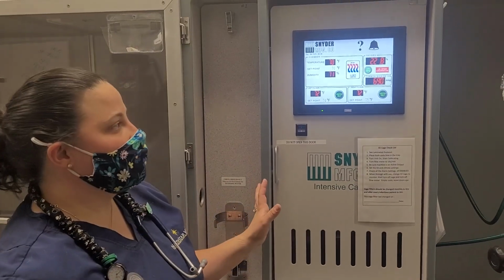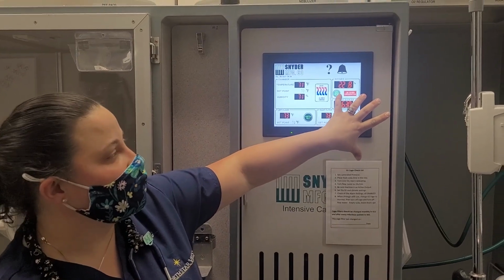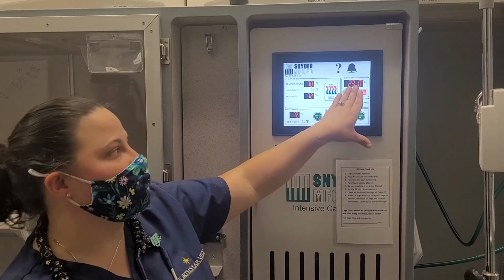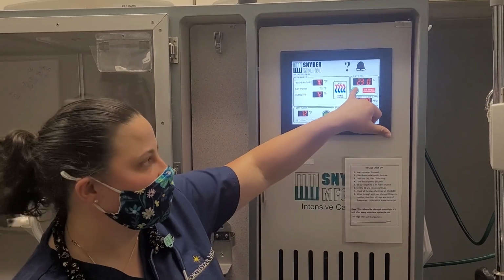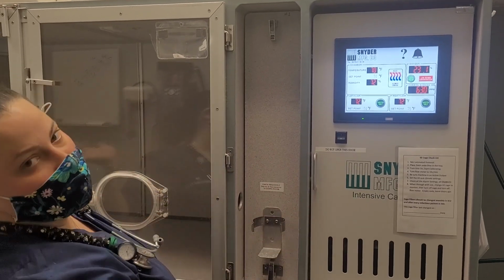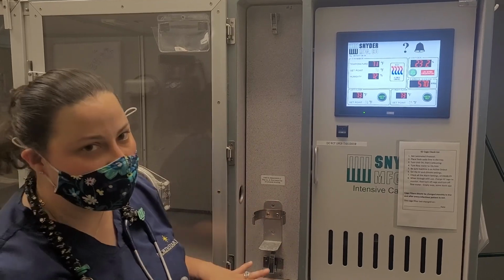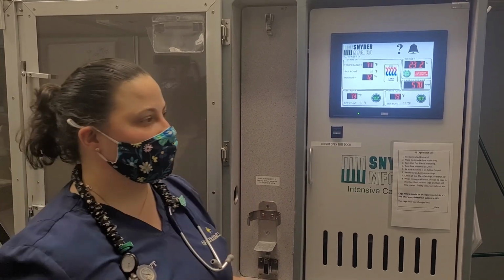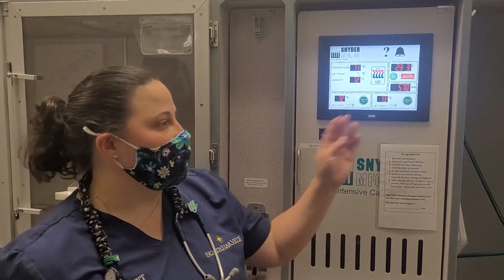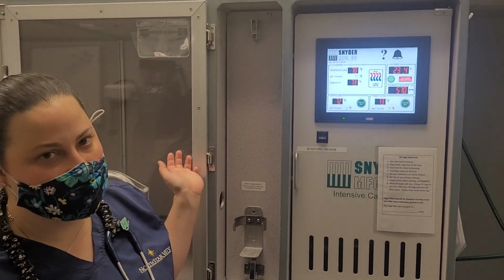So if you're also still having oxygen problems and your percentage still is not holding, or it still says a low percentage, say you're set to 40 but it's still showing you 23, you're going to have to shut your cage down, open all your doors for about 15 minutes to let everything recalibrate itself, and then go through the entire process of recalibrating your cage from square one all over again. From turning on the flow sensor all the way through to making sure that you don't have any leaks in your cage.